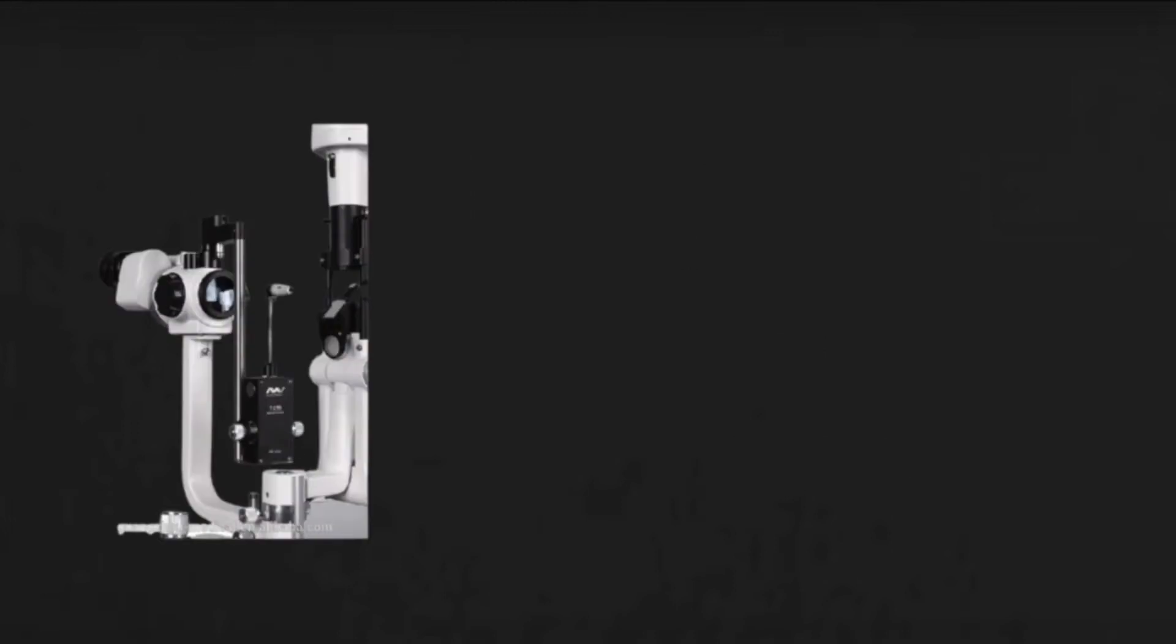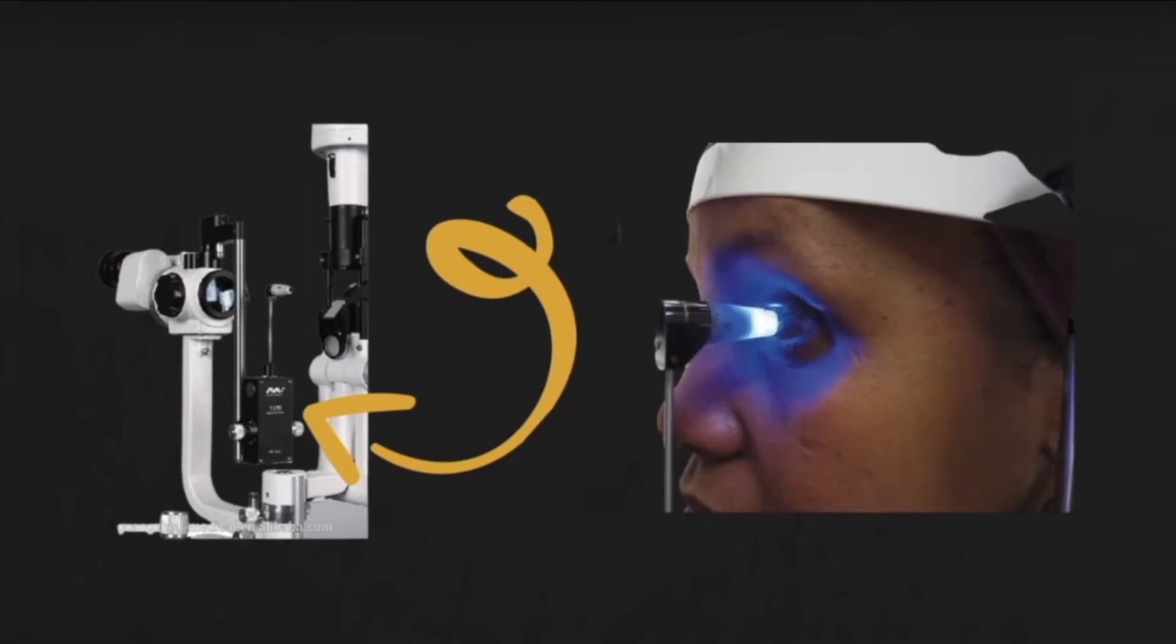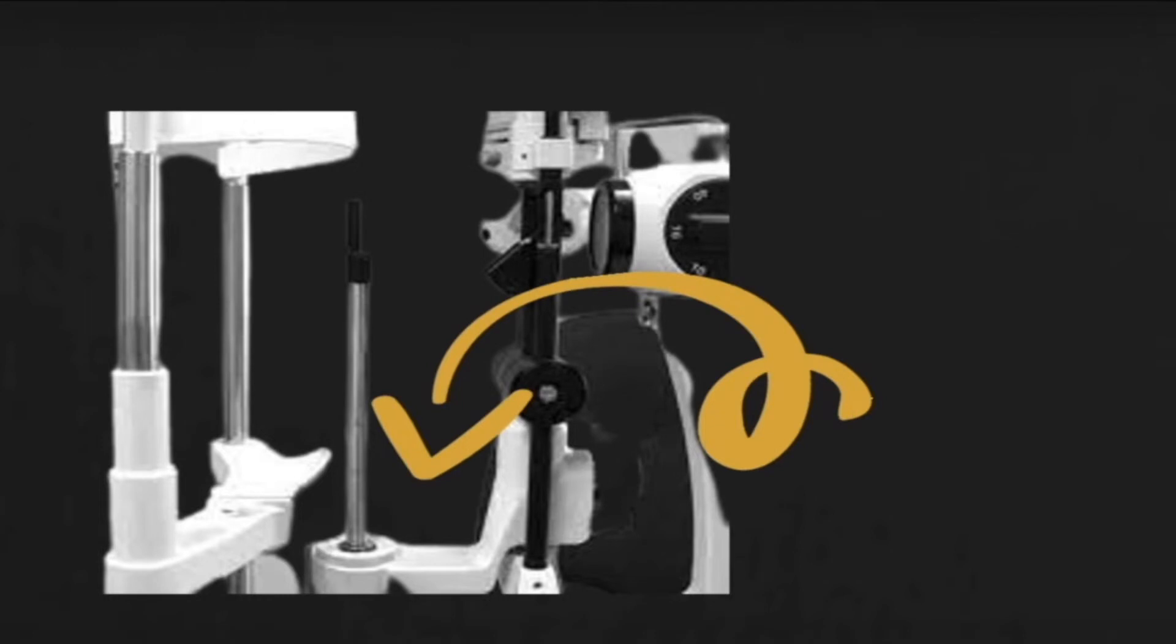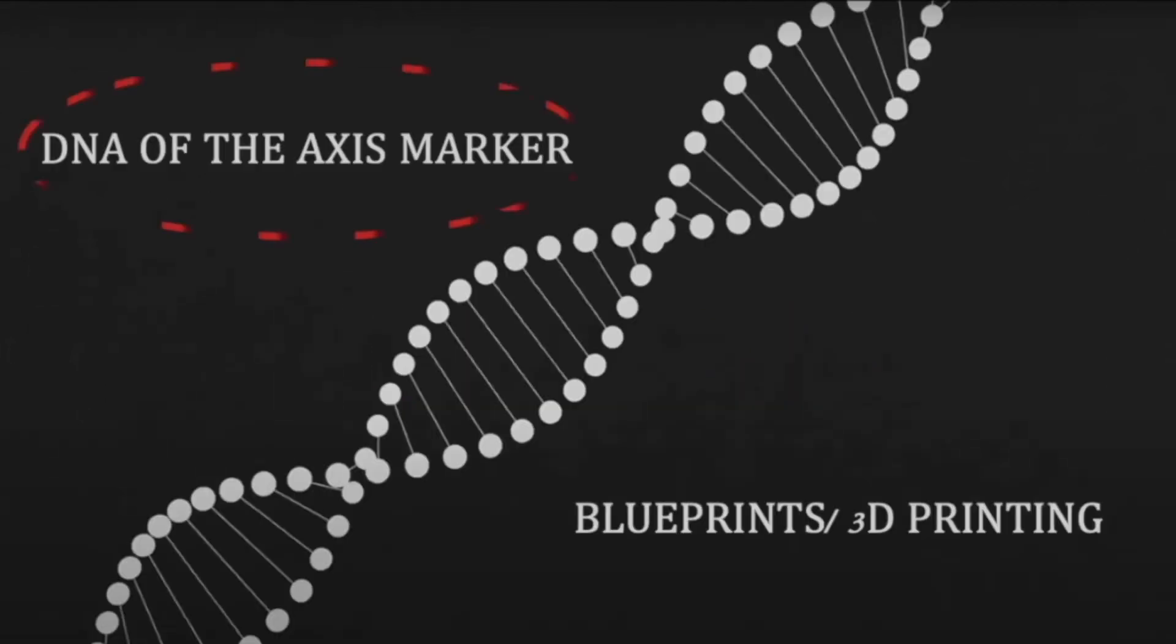So we had a research question: can we actually innovate an economical, accurate, stable, and easy to use toric marker? We took inspiration from the Goldman's applanation tonometer, which goes and indents the cornea of the patient and the patient is not hesitant at all. We decided to use the calibration slot which is universal in every slit lamp for our slit lamp-based toric marker.